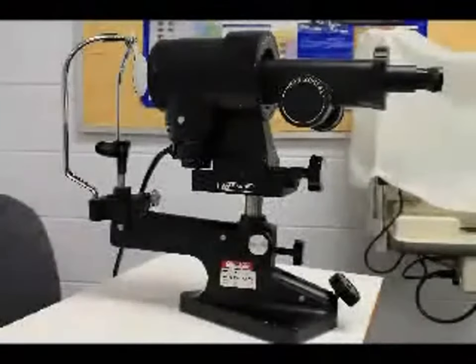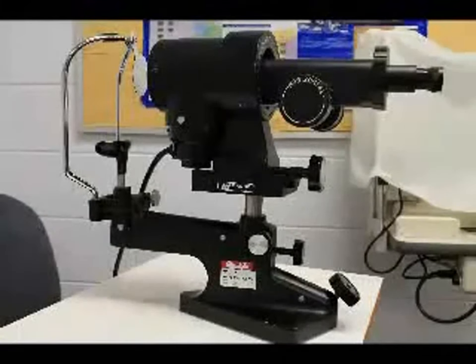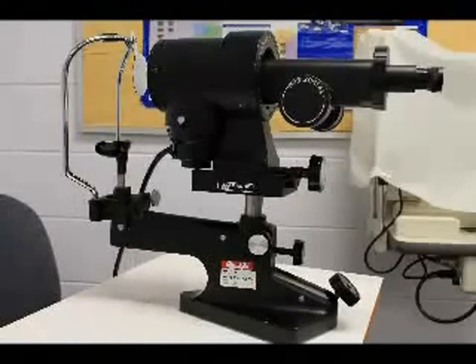This week you'll be learning about the keratometer. The keratometer is an instrument that serves two purposes: one, to identify the amount and type of corneal astigmatism, and two, to identify the proper base curve of the contact lens being fit to the patient's eye.